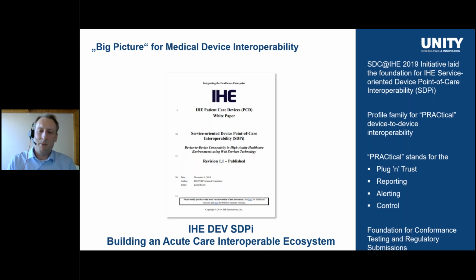So you can basically sum it up as IHE SD-PI paints the big picture for medical device interoperability from the medical device interface perspective, and it will be the foundation for conformance testing. And it also explains the use of the technology SDC in clinical use cases to other stakeholders.